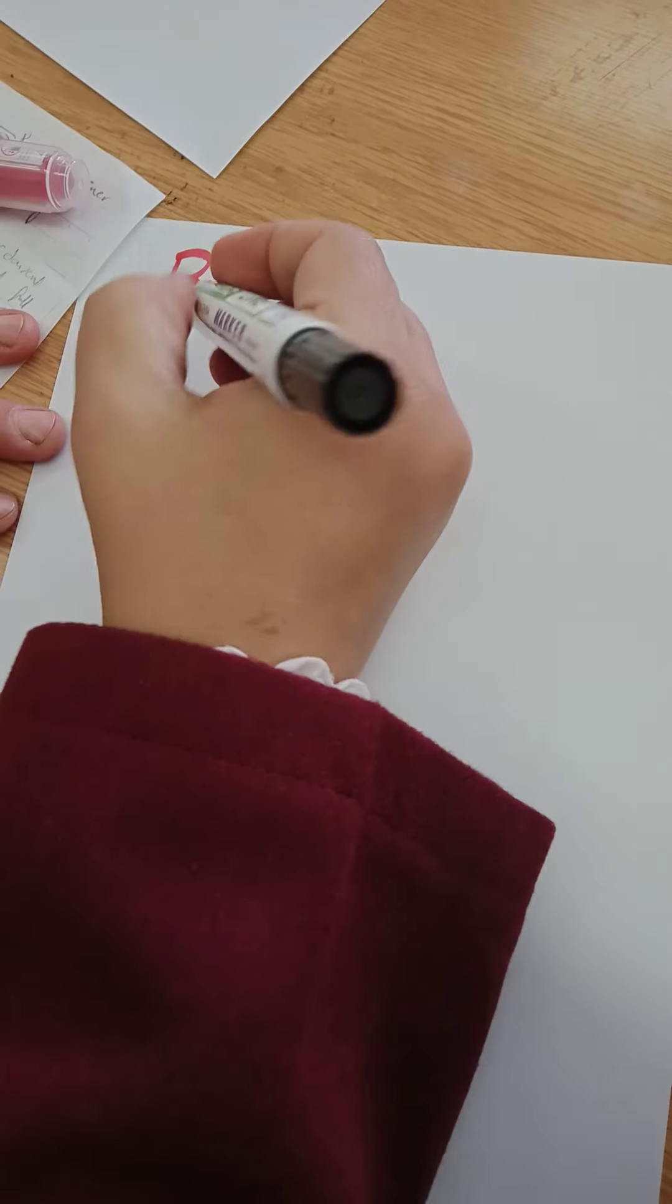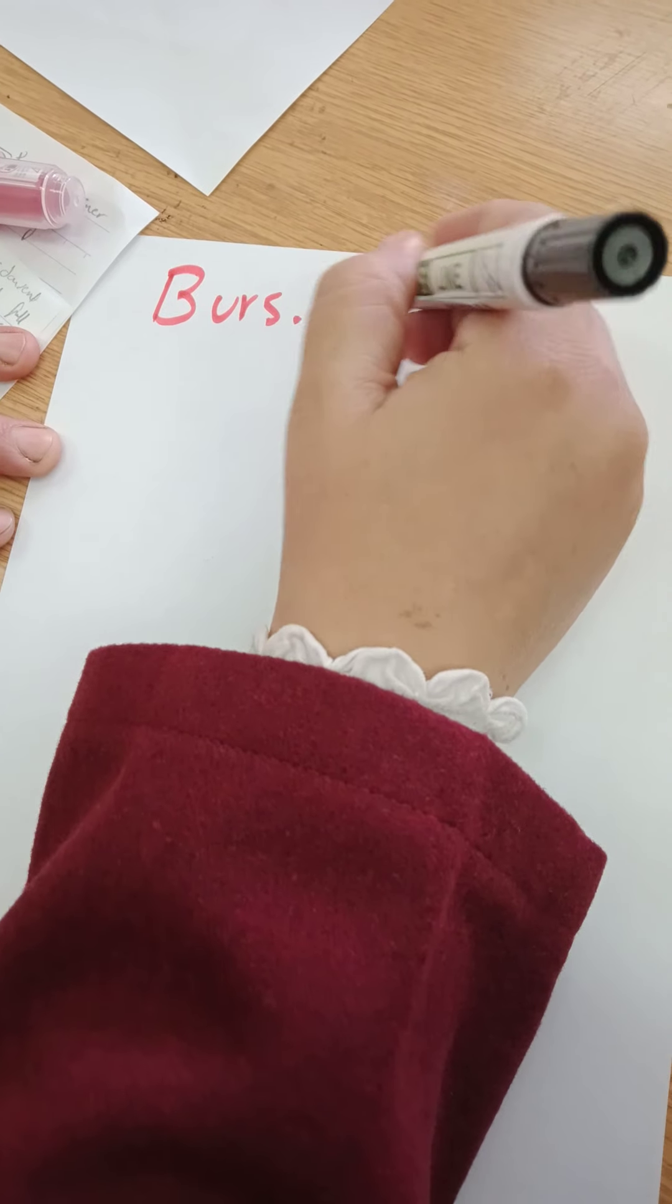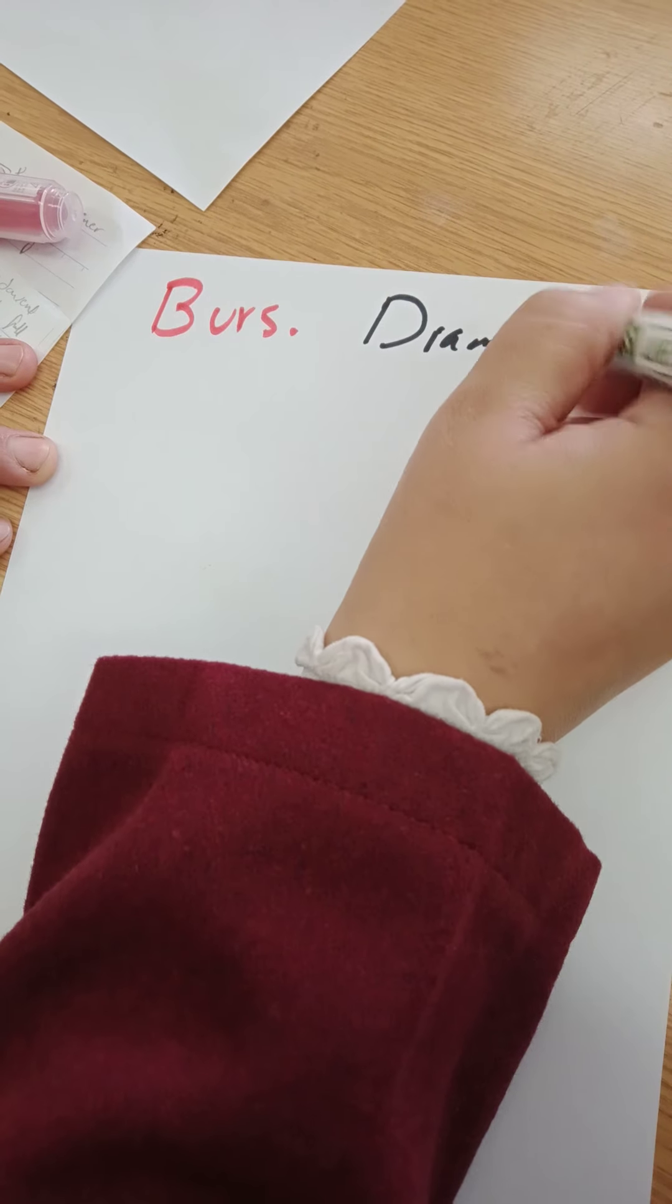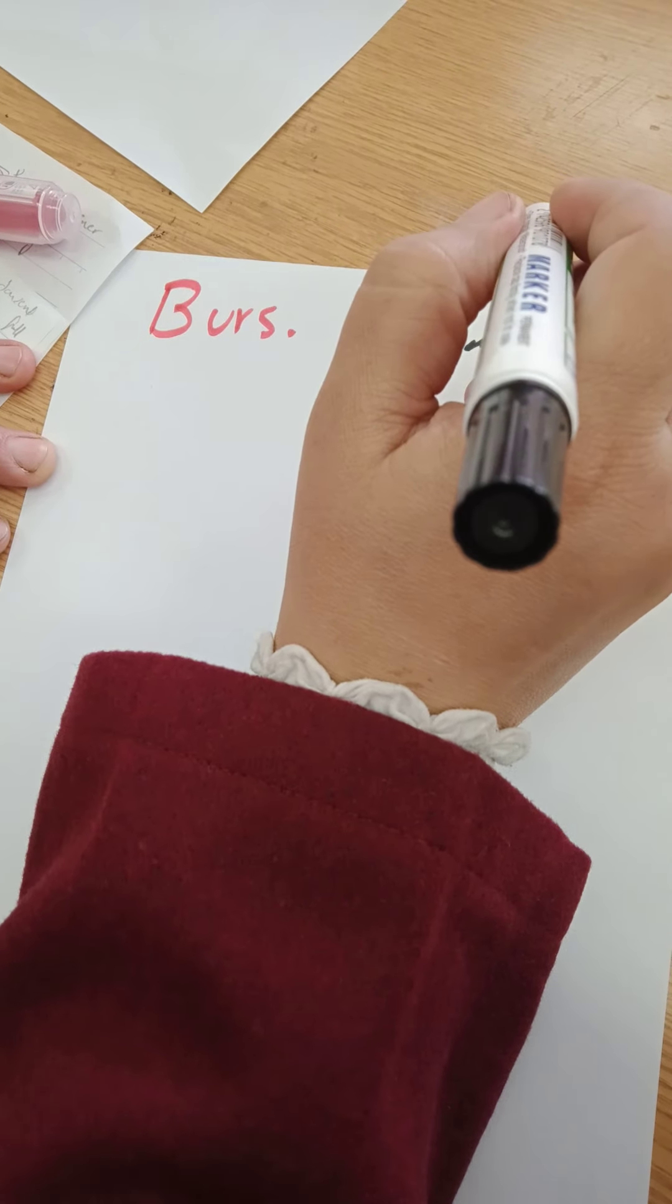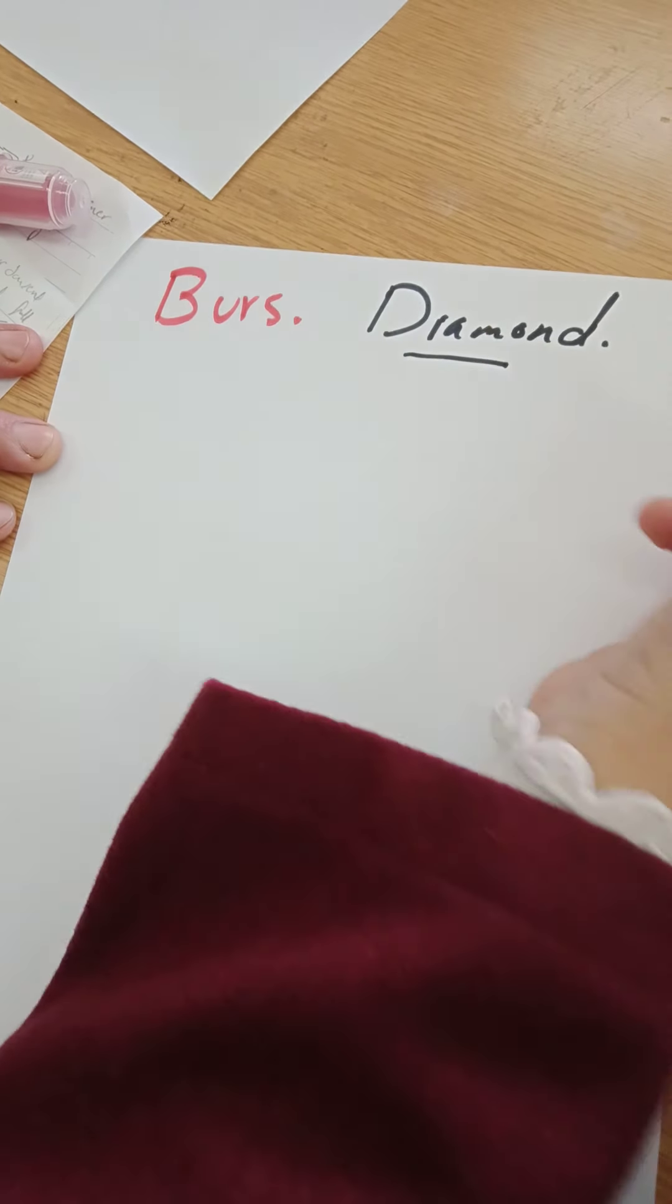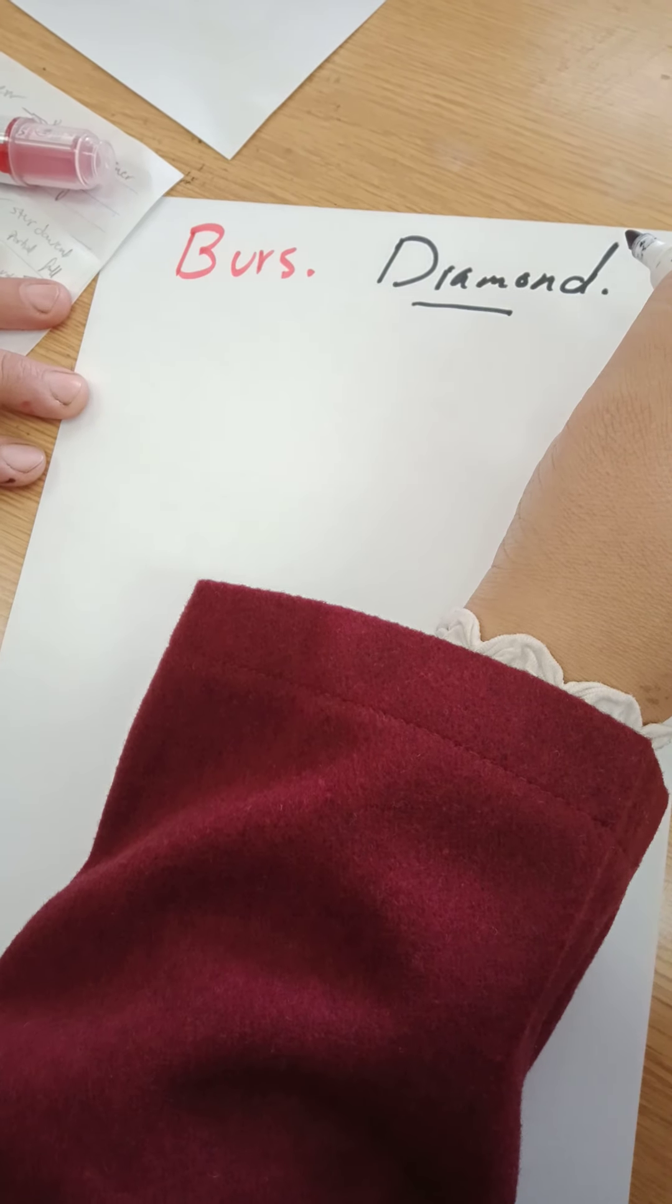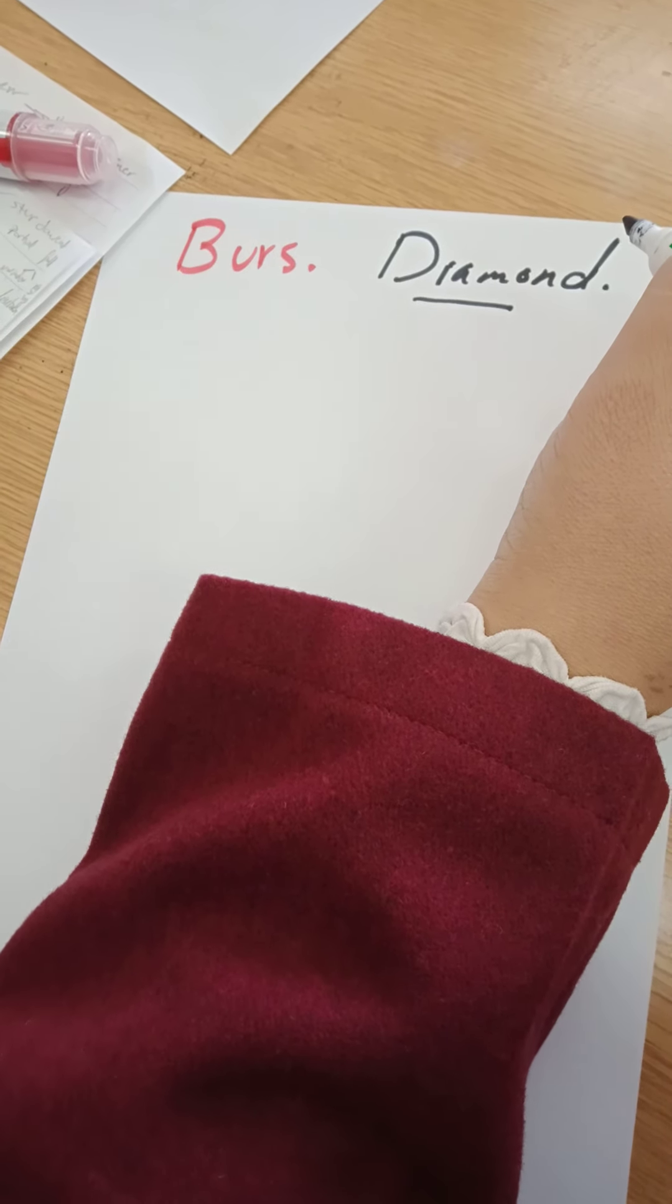Why diamond? So all burs should be diamond. Because these are the most suitable for preparing enamel. It's the cutting efficiency and the morphology of the prisms after cutting.